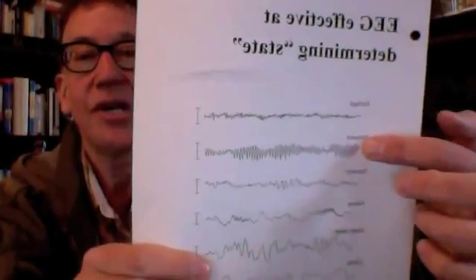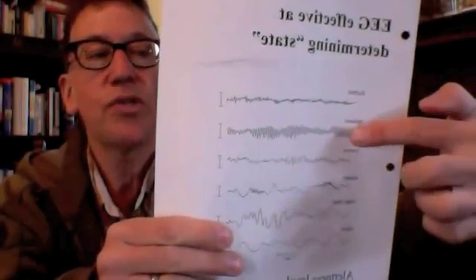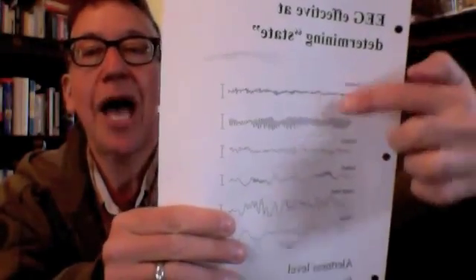If you close your eyes and just rest and relax, you might get this slightly slower alpha rhythm, which involves much higher amplitude waveforms. Much higher amplitude means a lot more neurons are firing at the same time, and that really reflects less information value.